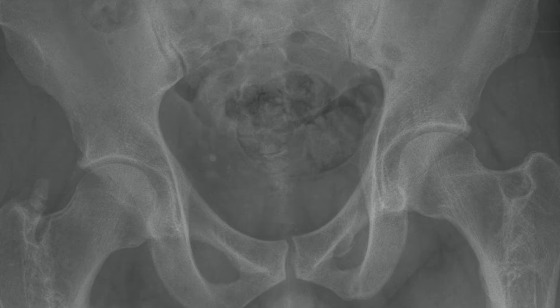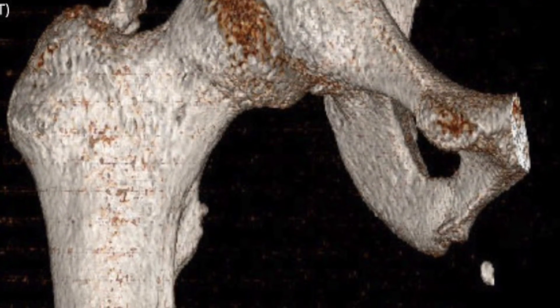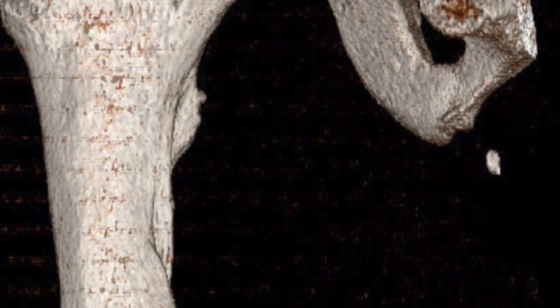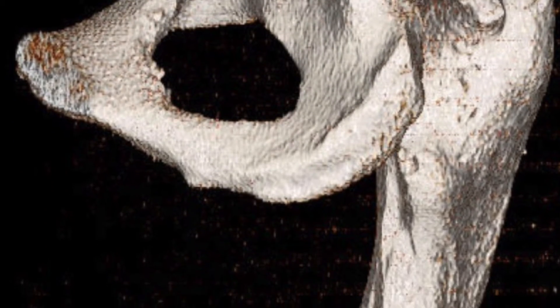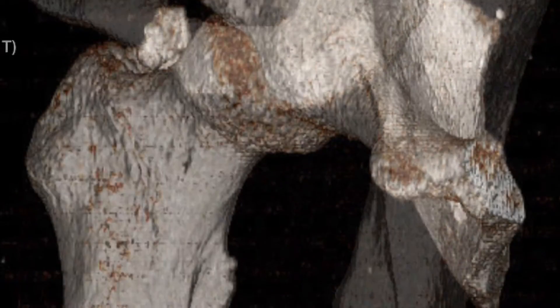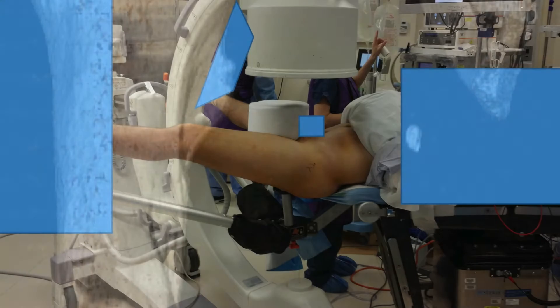This is a case of a 25-year-old man who underwent bilateral femoral nailing for limb lengthening and subsequently developed symptomatic HO in the piriformis fossa. He had seen several hip arthroscopists who did not recommend arthroscopic excision because of the posterior location of the HO and its proximity to the sciatic nerve. This pearl shares how to successfully remove HO from the piriformis fossa.